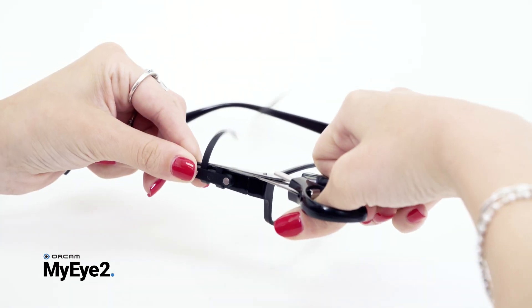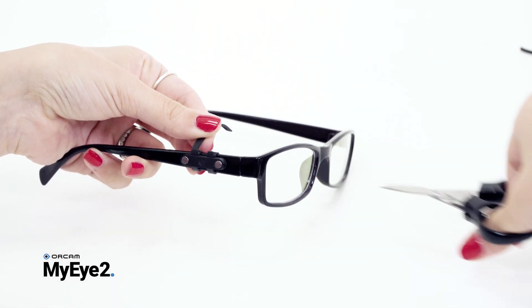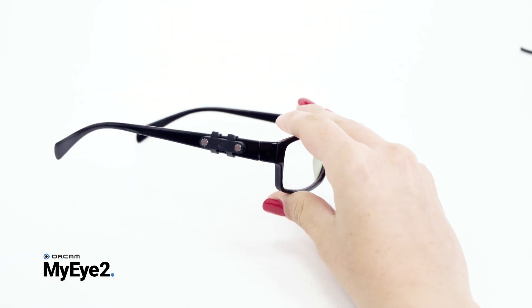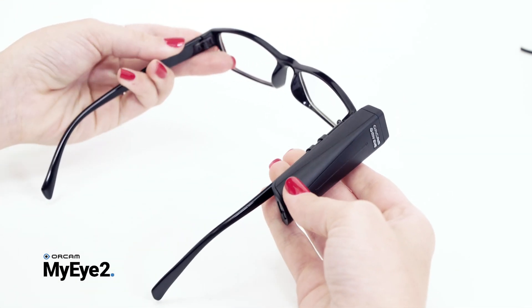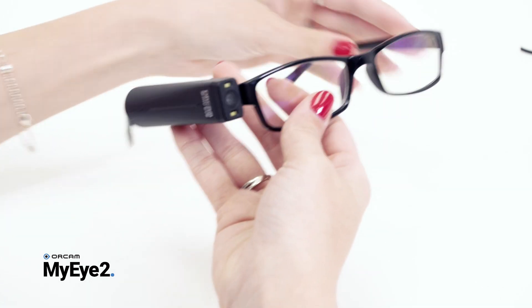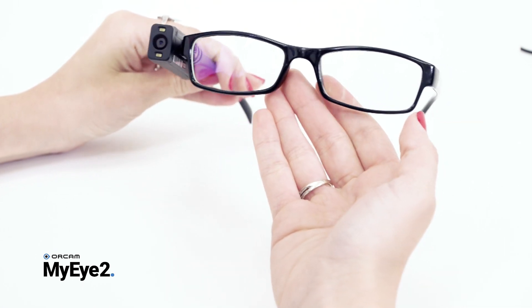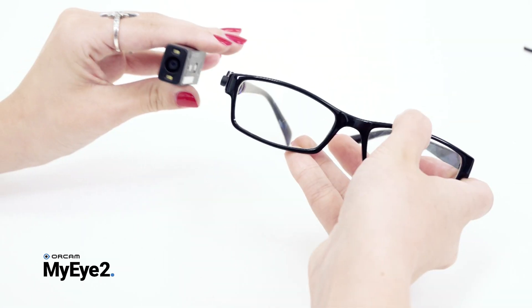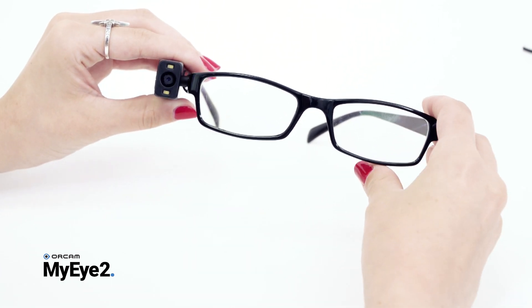Now carefully cut off the remains of the straps protruding above the mount with the small scissors. Verify the mount is positioned correctly and attach the device to the mount. Ensure the device is parallel to the arm of the glasses frame with the camera view straight forward and aligned with the front of your glasses. The OrCam device can now snap into place. The glasses frame can be folded with the mount attached.